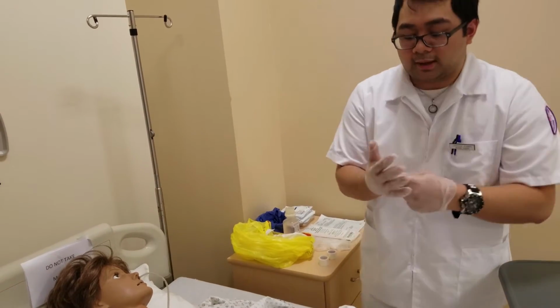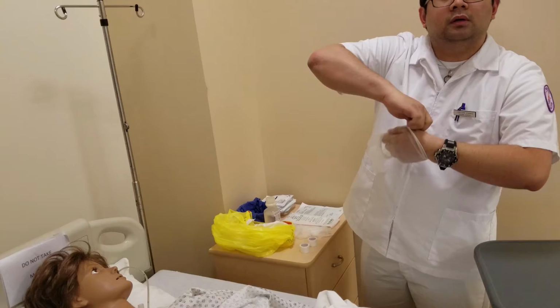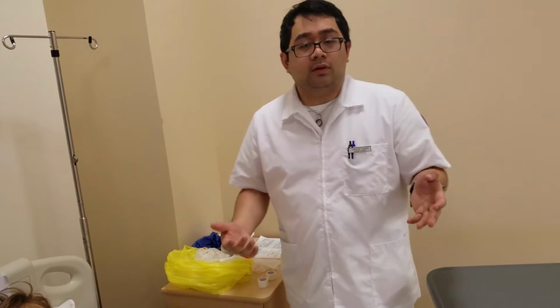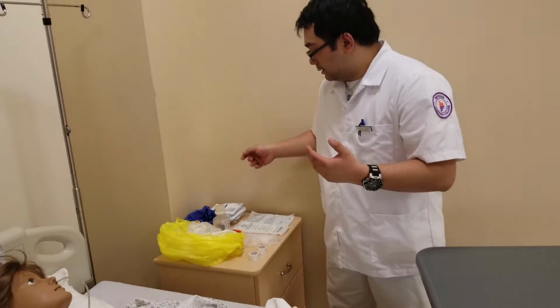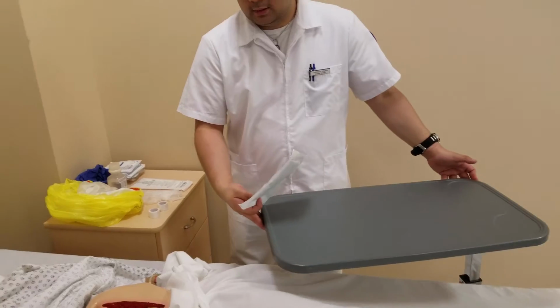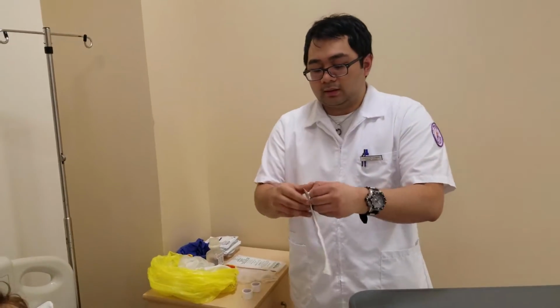So our next step is to remove our gloves. Then we're just going to wash our hands. If that's not really available for you, use some hand sanitizer and get that over and done with, because we're going to be now setting up our sterile field. So I have a table right here, and you may want two, just in case.